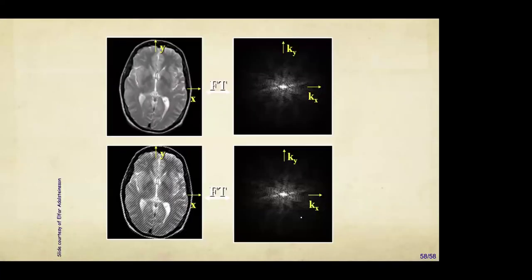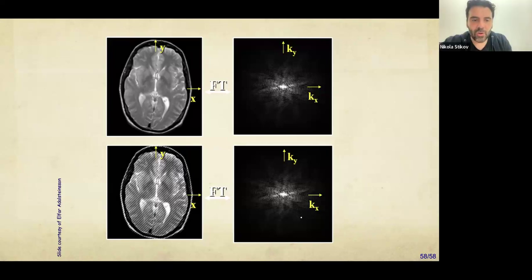I think we have a question. Yeah, go ahead. How would you correct images that have artifacts in them? Right. So, I mean, there's different ways. Sometimes you just deal with the artifacts. Sometimes the artifacts are just inherent and you will just leave them inside because there's not much you can do. For example, if you have certain spiral trajectories, your artifacts will look like a little bit twisted brains, okay? And there's not much you can do about that.